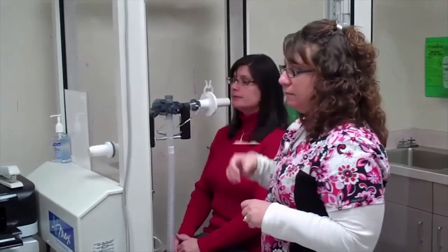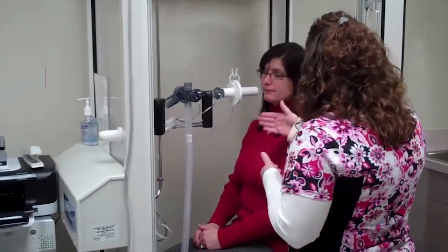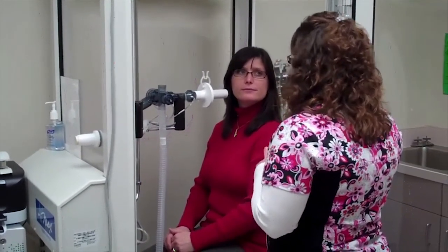Next part of the test is plethysmography, and this assesses the patient's lung capacity, particularly good for assessing scar processes. Okay, for this set of tests, I have to close the door. Your mouth's going to go all the way around that again. Clips on your nose. You're going to start out breathing normal until I tell you. When I tell you, take a deep breath in, blow it out, go back to normal breathing. Then I'm going to have you start doing quick little pants.